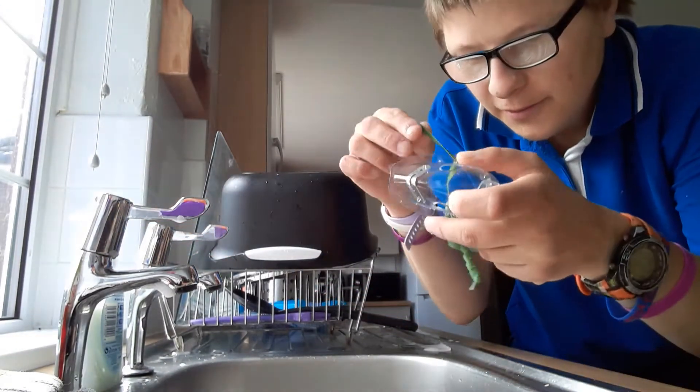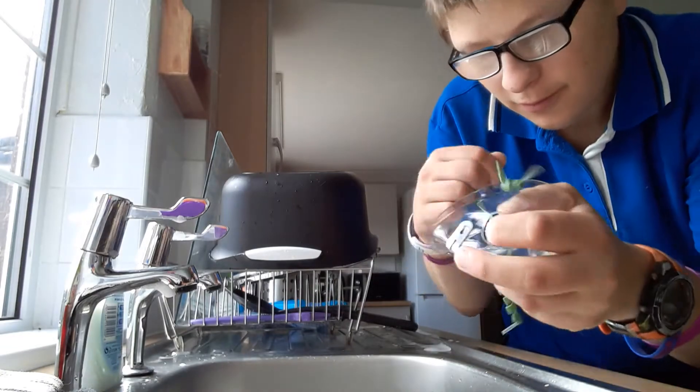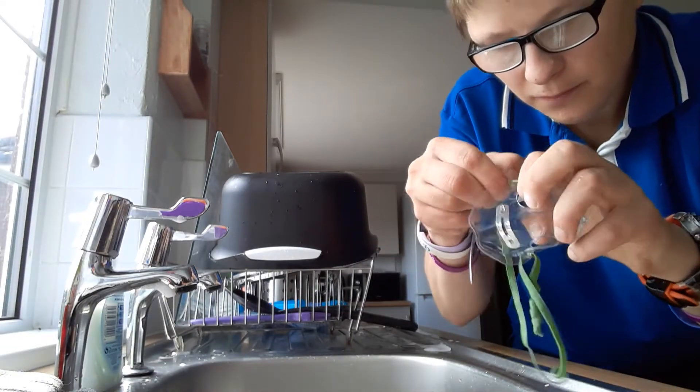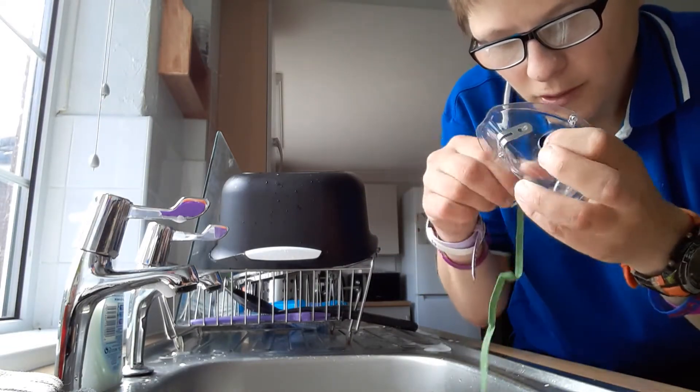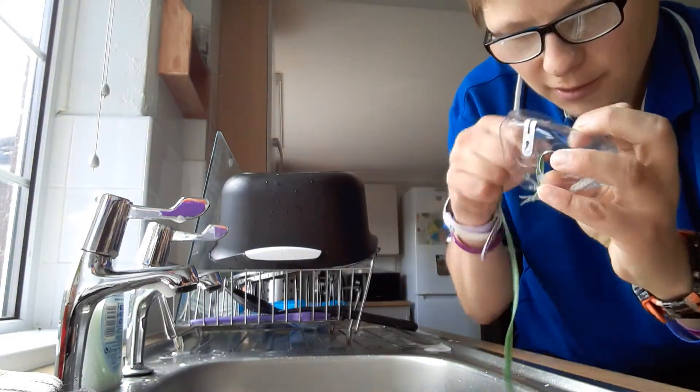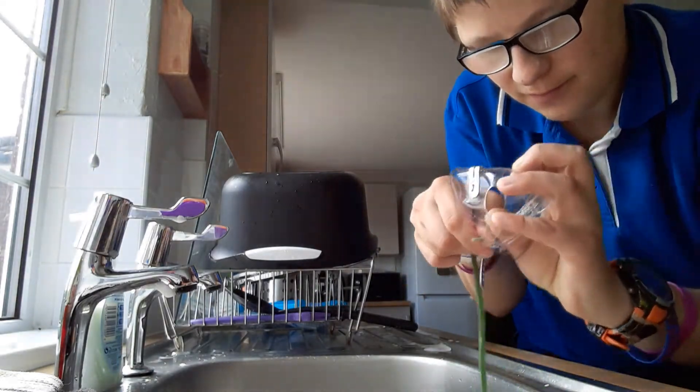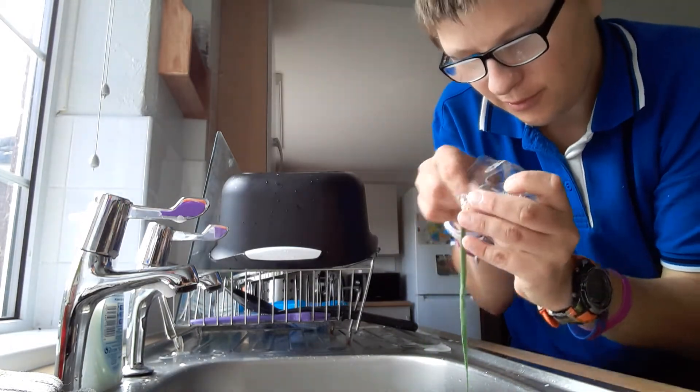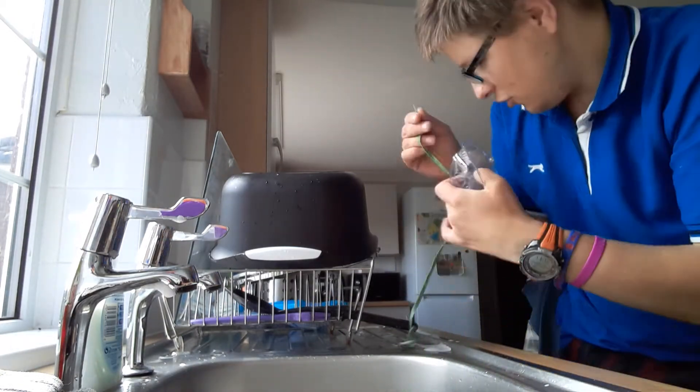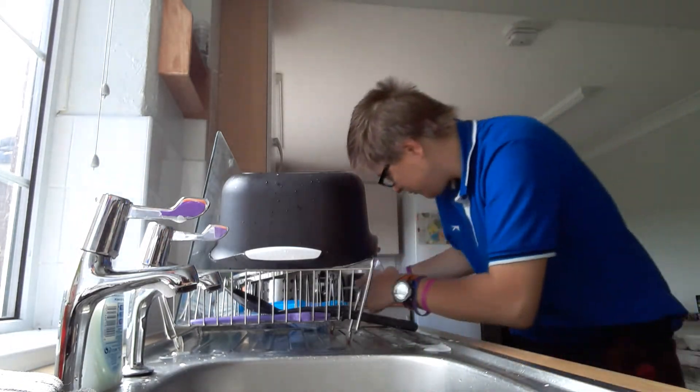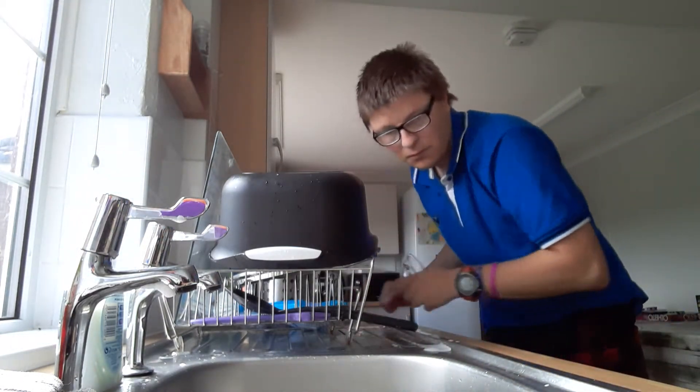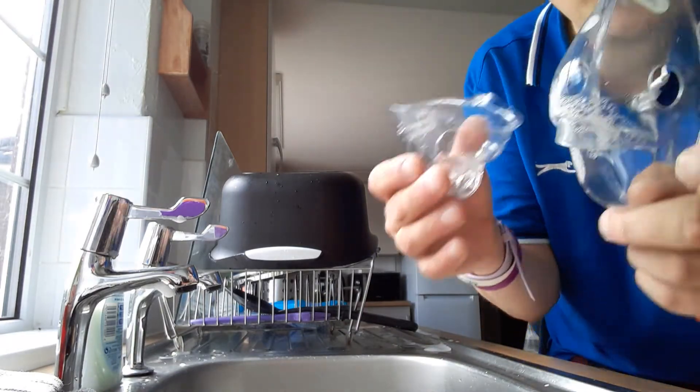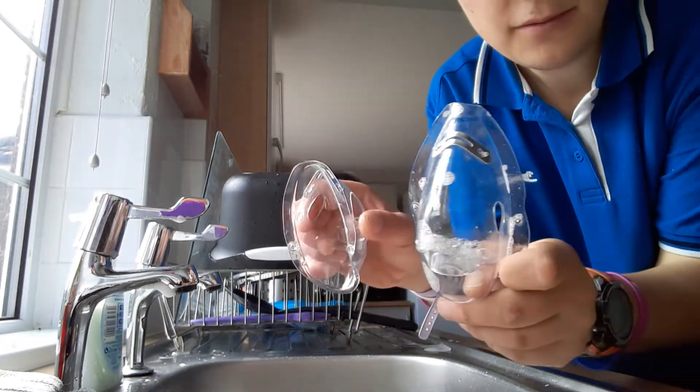Firstly, I'm taking the strap off the mask. There are two masks here, a child mask and an adult mask.